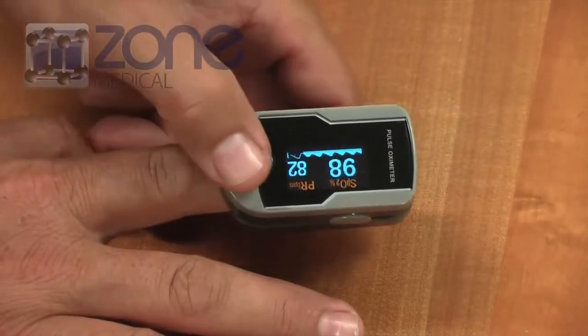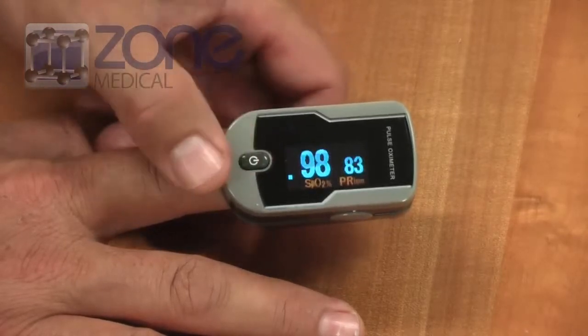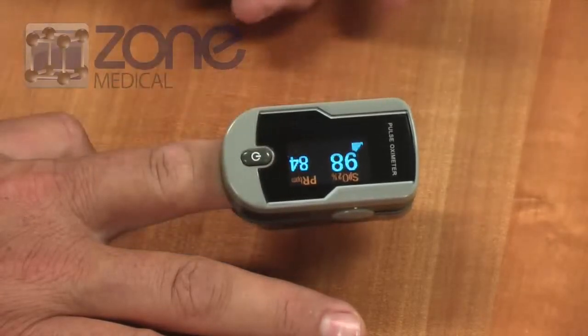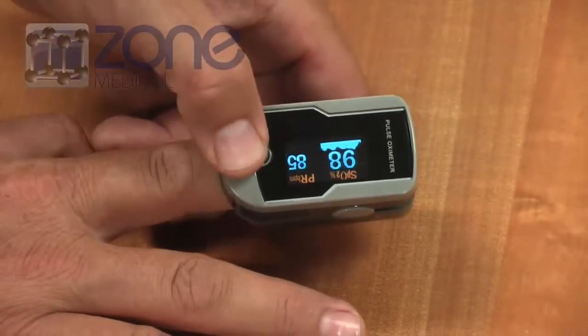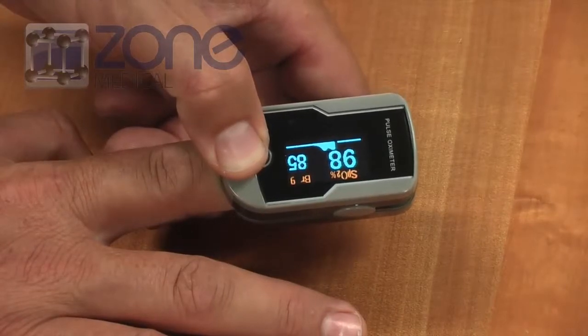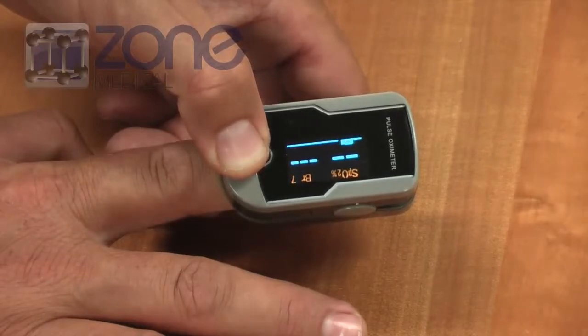Pressing the button will rotate the screen and change the size of the numeric display. Pressing and holding the button will increase the brightness. There are ten different levels of brightness, which can be used to decrease the battery life.